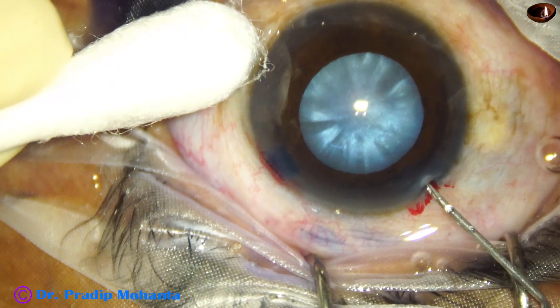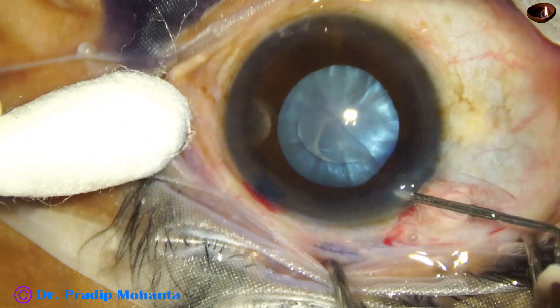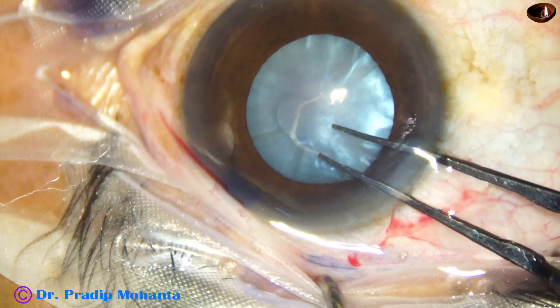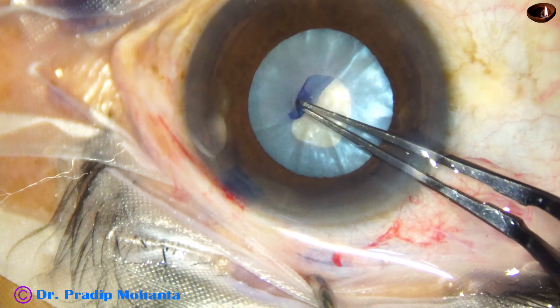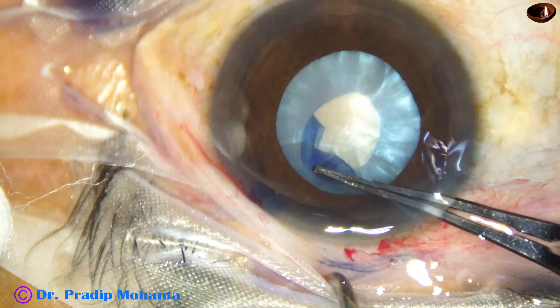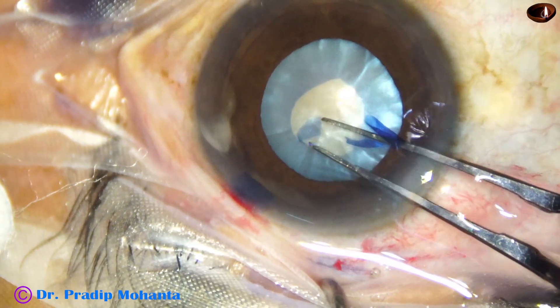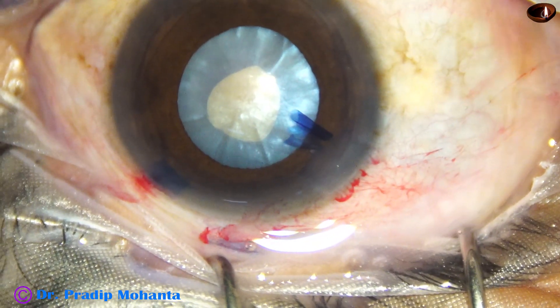This is an intumescent cataract and I am planning a double-twisted rhexis. This is a CCC flap made by a needle. There is a study at Aravind Madurai that this CCC flap keeps some guard over the Argentine flag sign, so if we can make a CCC flap, the Argentine flag sign usually does not occur.